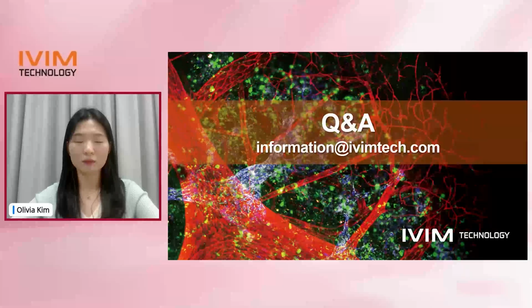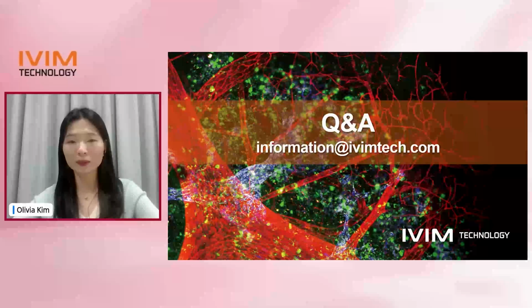Question number one is, for long-term imaging, do you keep the mouse on the microscope continuously? It depends on the experimental design. In many cases, imaging is performed at specific time points, such as 2, 6, 12, and 24 hours.